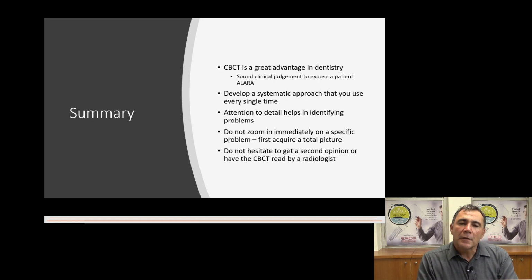Do not hesitate to get a second opinion or have the CBCT read by a radiologist. I read x-rays every day, yet it is no problem for me to run up to the radiology department and get a second opinion, and I do it often. Do not let your ego stand in your way. Get a second opinion. It is to the best of your patient.